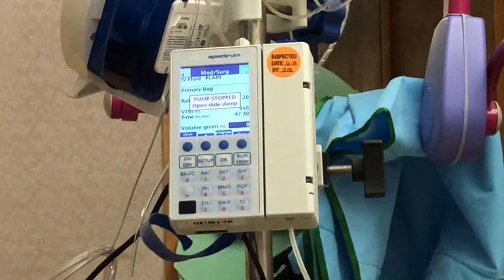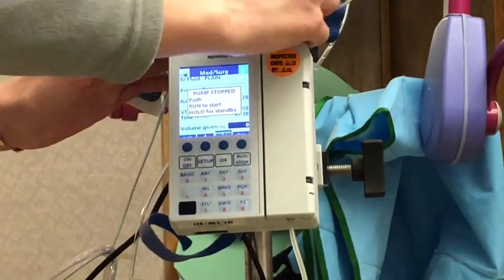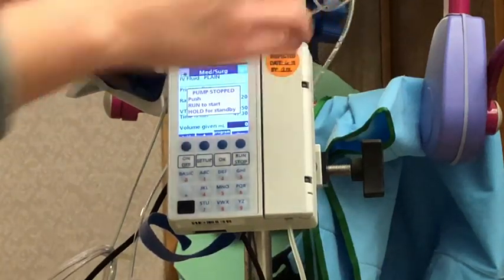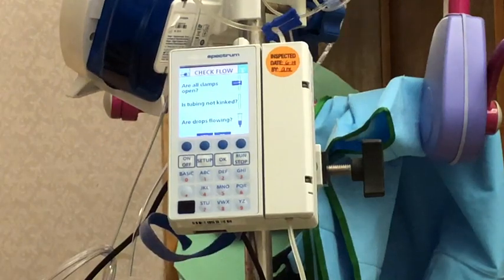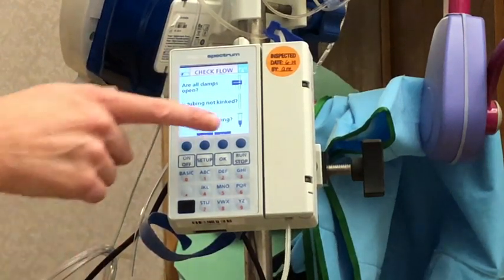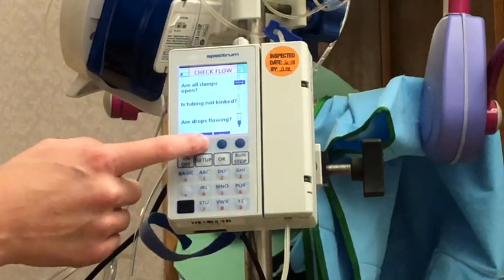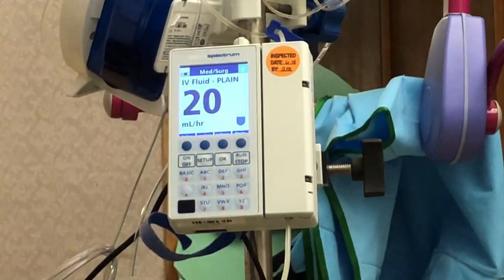It's going to tell me that I need to open my slide clamp and release the one up here. Open that, make sure that's open. Then I'm going to hit run and it's going to ask me again to check all my connections and make sure everything is open — and it is. It'll ask you to look for drips in the chamber, and they're there, so I'm going to hit yes. Then it's going to tell you what's infusing.